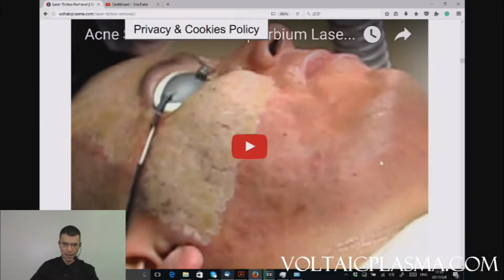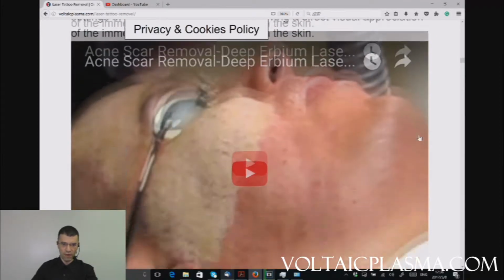This is a video which shows you clearly the frosting effect of acne scar fading treatment. So this has been put in place just to give you an example where the principle is the same, the physics are the same, but the application is different. So you get the same type of lasers, but applied on another area of the body for another application, which in this case is acne scar fading.